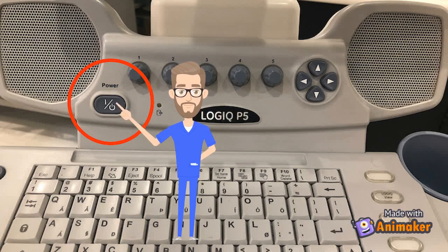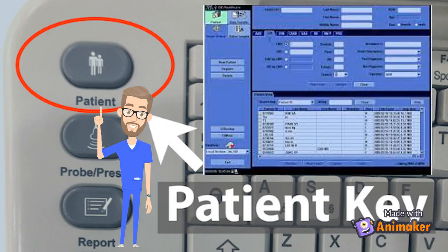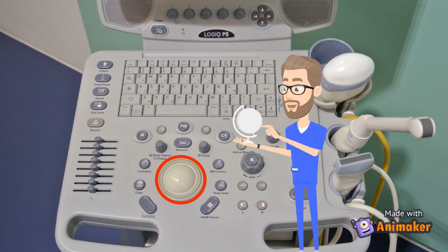It is fairly simple to make that happen. Press the power on/off switch to turn the power on, press it again and you can turn the power off when you are finished. Pressing the patient key on the keyboard will display the patient screen on your monitor. Selecting New Patient automatically saves all patient data, annotations, measurements, calculations and worksheets of the last exam. Since images are not automatically stored, a warning message will appear asking if you'd like your images to be erased or saved.